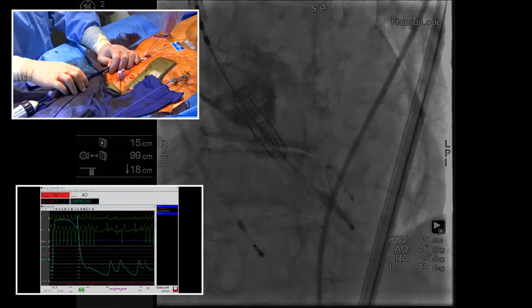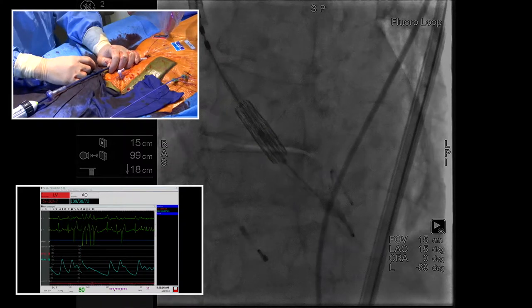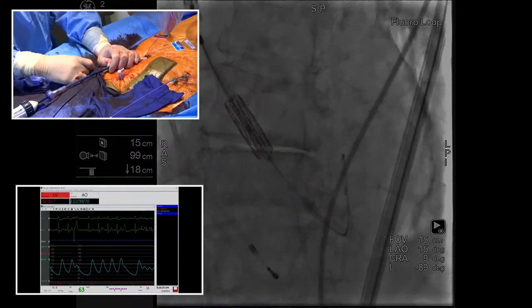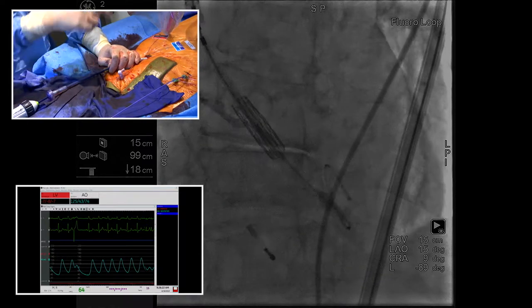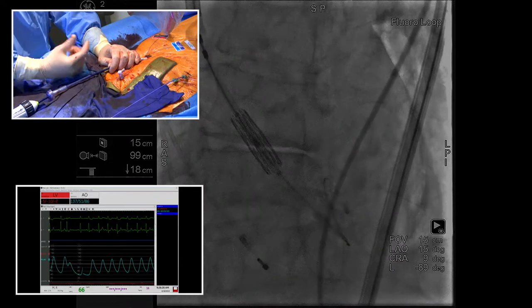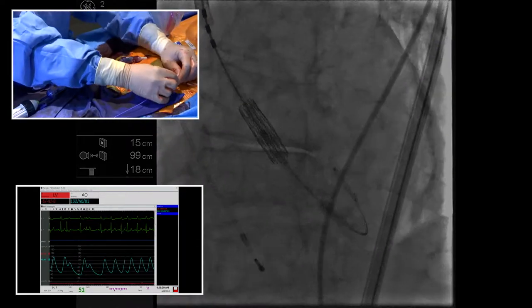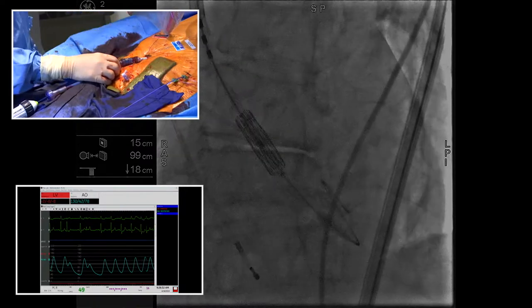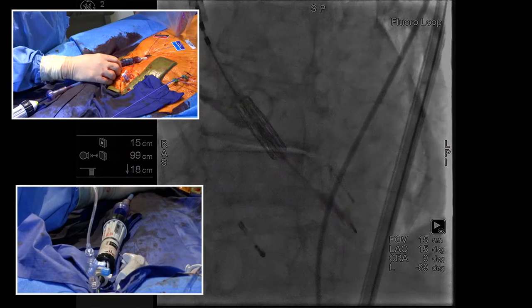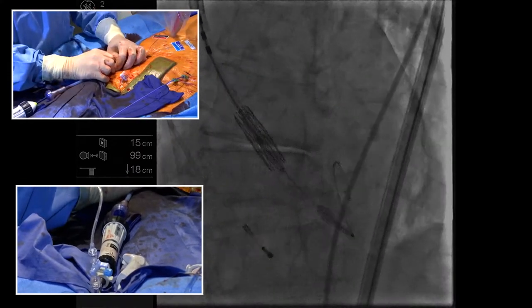I do this thing also, not everyone does this. If you look, you can see some calcium pointing at the valve before the dye comes in, and that should be right in the middle of the first marker and the middle marker. And it sort of is. It gives me some visual clue. Now I'm going to take the pig away. I think it dropped down. See that? Maybe you're okay. On the beat, I think we just caught it. It's going to come up again during the pacing.